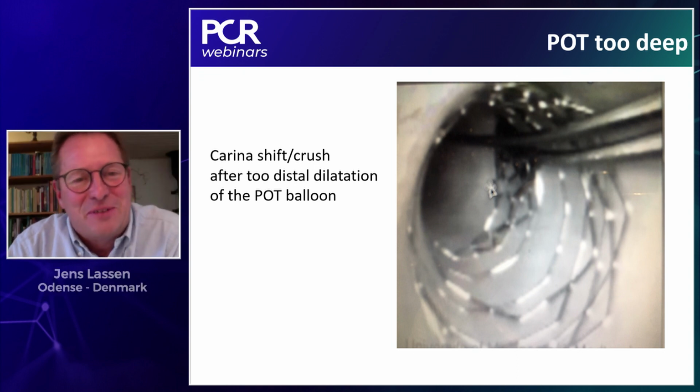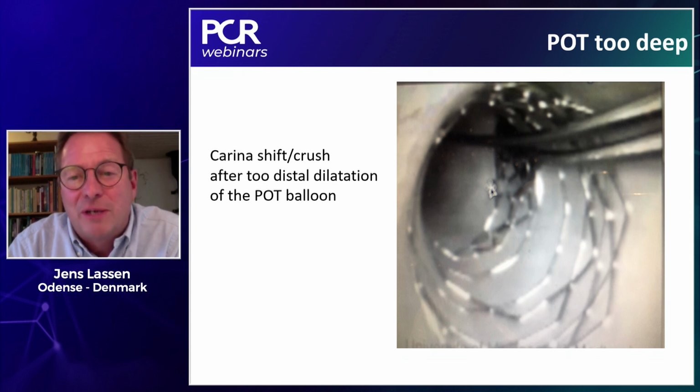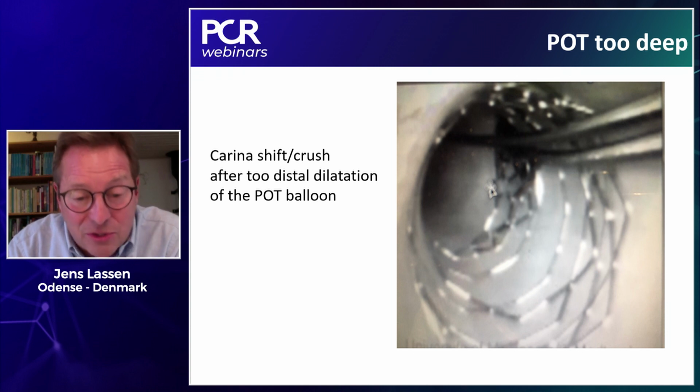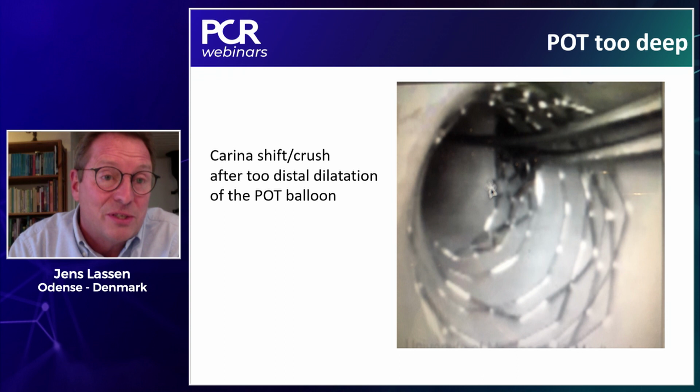Well, this is not a very good idea, and I think that we can answer that question easily later in this webinar, where we have a clear example why the jailed wire is extremely important. It is actually our safety line. So we don't recommend to remove the jailed wire before POT. We strictly recommend to keep it in place. And it was an excellent question, actually.